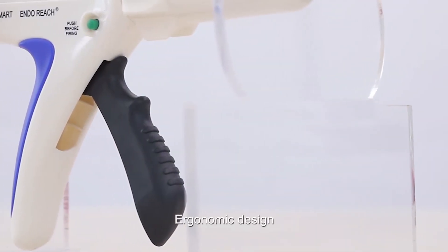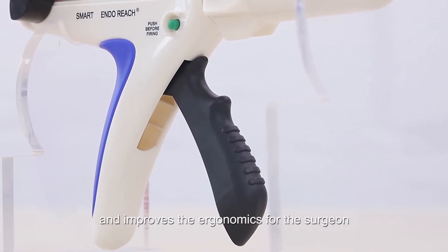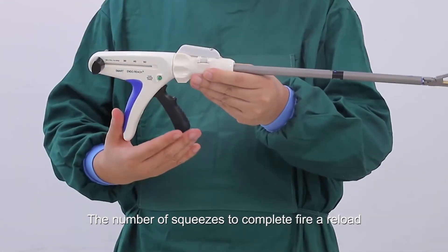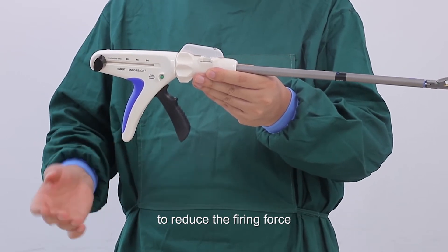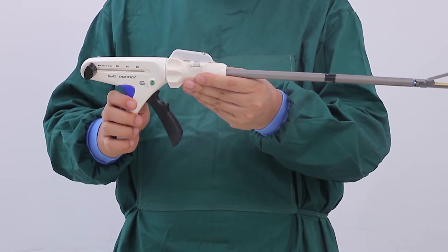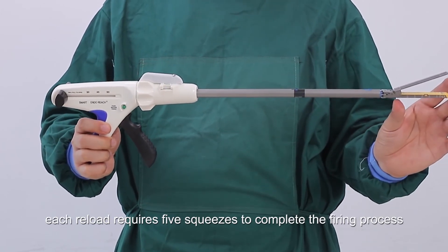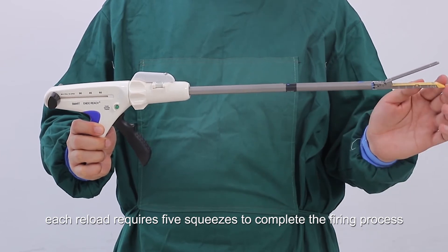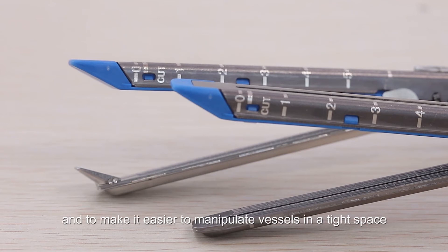Third, ergonomic design. A new handle design prevents slippage and improves ergonomics for the surgeon when gripping the trigger. The number of squeezes to completely fire a reload has been increased compared to the previous version to reduce the firing force. In the case of a 60mm reload, for example, each reload requires five squeezes to complete the firing process. We have also introduced a new curved tip design to improve efficiency during surgery and to make it easier to manipulate vessels in a tight space.